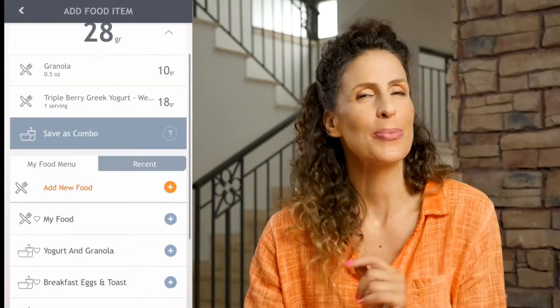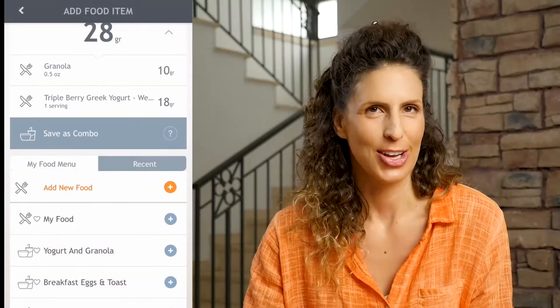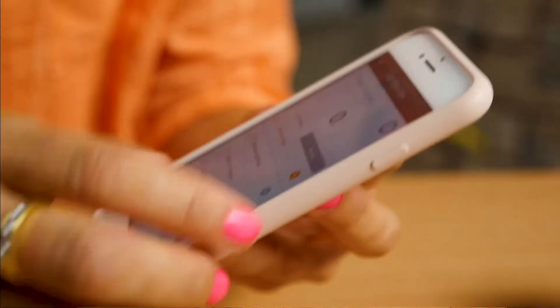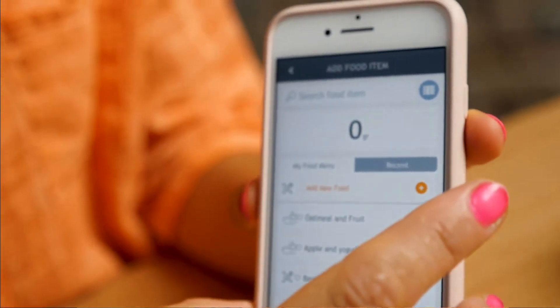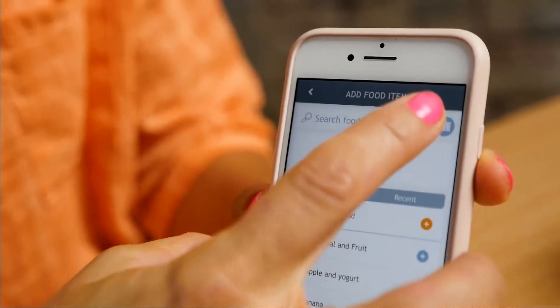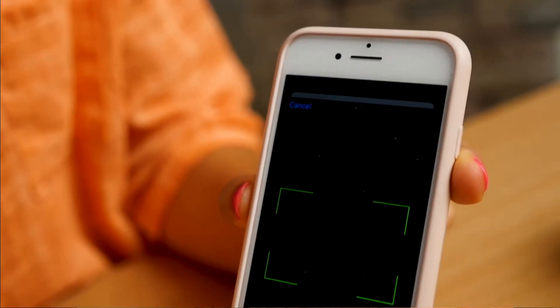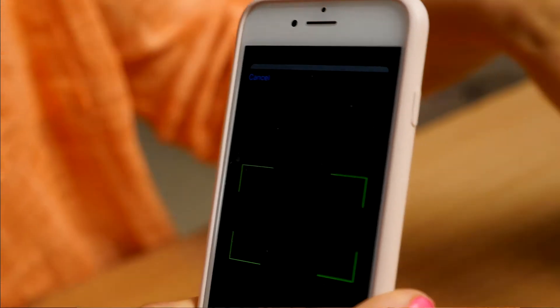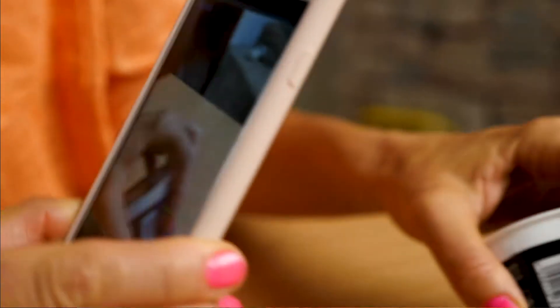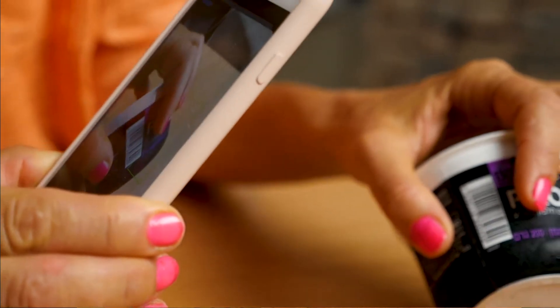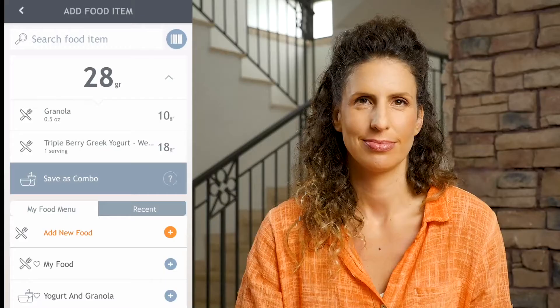There's one more great way to track your carbs and that's the barcode scanner. By simply scanning the barcode of any packaged food, the app imports the carb value and adds it to your food log.